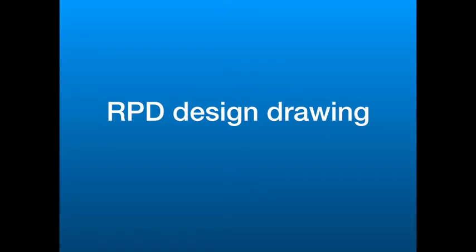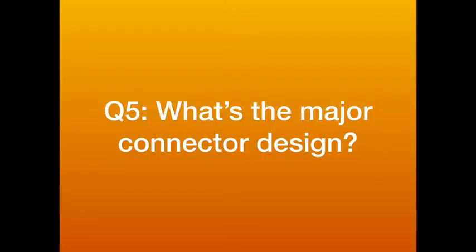After those, you will have your idea how you can design your cast, and you will start drawing the design. So remember, you should verify the classification. You should know how many teeth are abutments. And the third question is about how you can design a clasp. If you need to modify it, how you modify that. After that, it'll come into the design drawing.